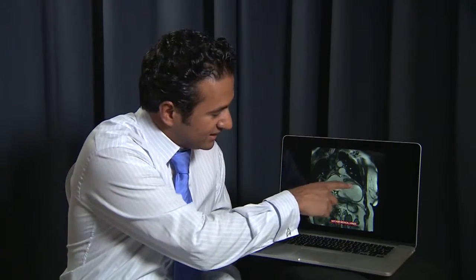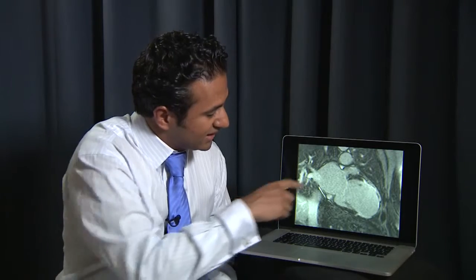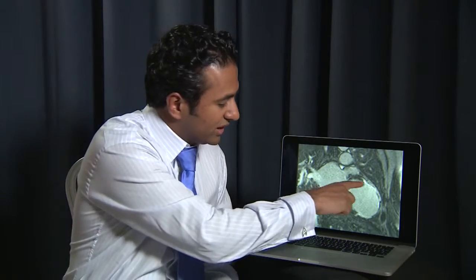We can see here that this part is not contracting well at all — it is almost still. When we give contrast, we give a contrast agent which is a dye called gadolinium. This accumulates anywhere that is scarred, in any part of the myocardium that is fibrotic. We can see that the part of the myocardium that wasn't contracting well is all enhancing — this is all dead tissue, irreversibly scarred tissue.